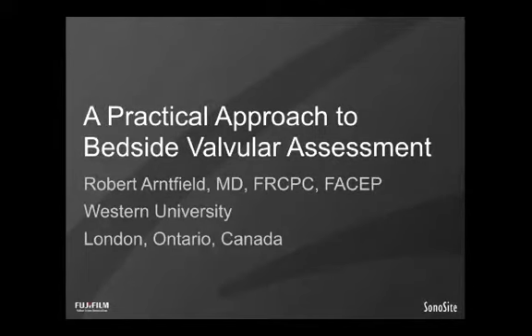And today's screencast is going to cover the topic of valvular assessment using point of care echocardiography. This screencast will fall into a suite of different screencasts that you've undoubtedly seen on the Institute discussing more sophisticated topics related to point of care echo.